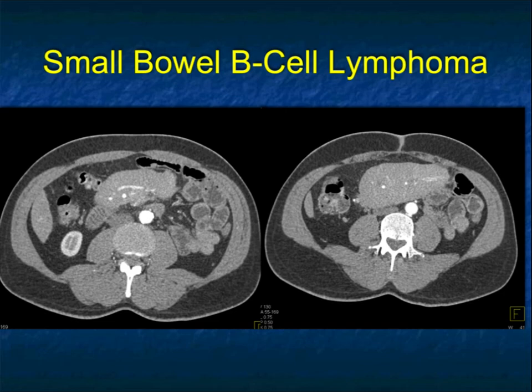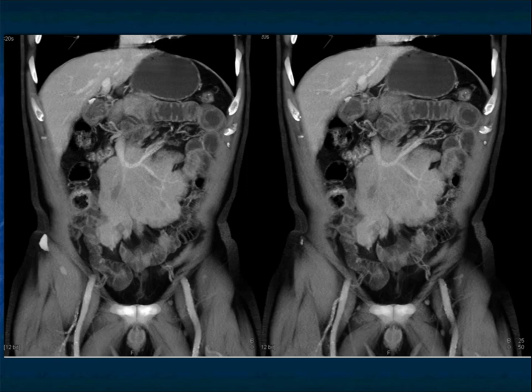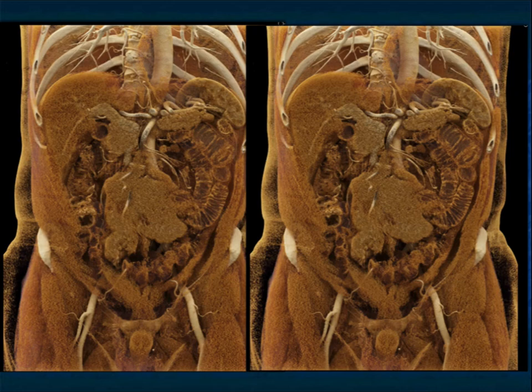Another example: lymphoma can involve the mesenteric vessels — the so-called sandwich sign. Here's a bulky lesion encasing the artery and vein sitting right in the middle. You can see how it infiltrates on the coronal view. Small bowel lymphoma in the mesentery can extend almost like infiltration, getting bulky while often not causing obstruction. That's one feature very helpful in the differential diagnosis. Here it is on volume rendering and cinematic rendering showing the mass encasing the mesenteric vessels — very classic for lymphoma.